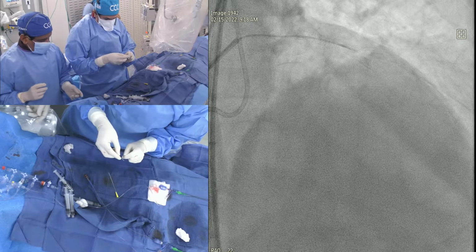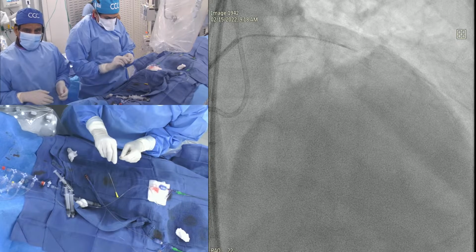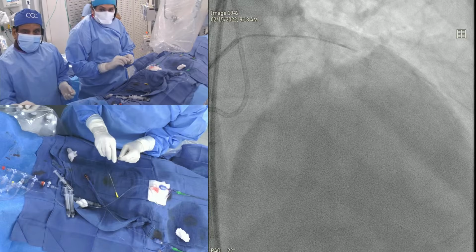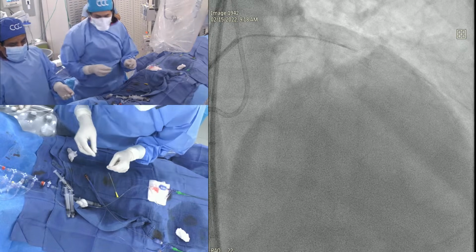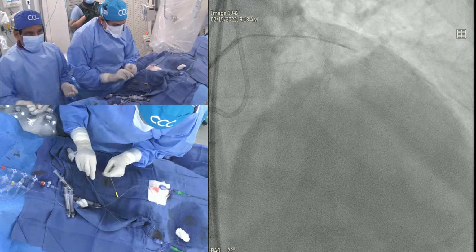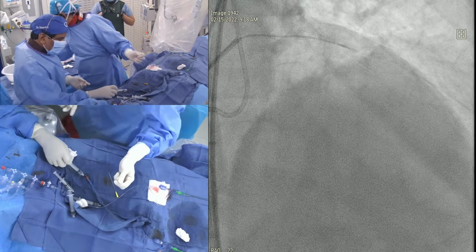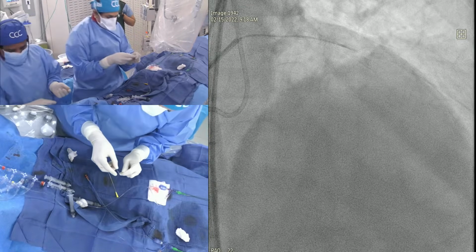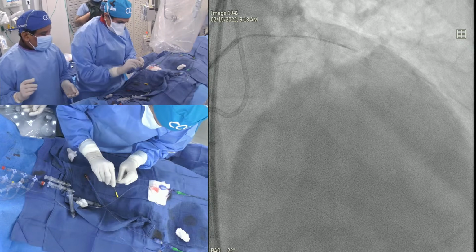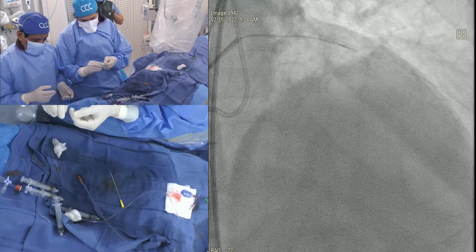Who makes the Cyan wires? Asahi. Also Asahi. Abbott? Which is Abbott, no? You can go on the app and check it. Asahi is separate from Abbott now. They used to be Abbott. No, they were never Abbott. Abbott was a distributor, marketing distributor. But now they are no longer, they became independent in the US. They make their own. They may be having some other products down the line, which we too don't know about. That's fine.